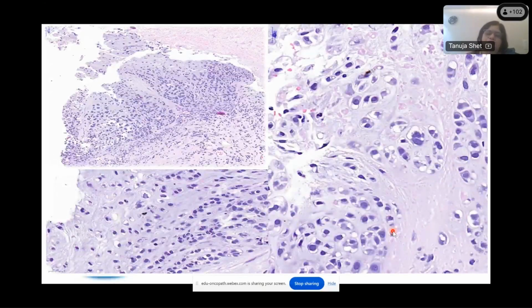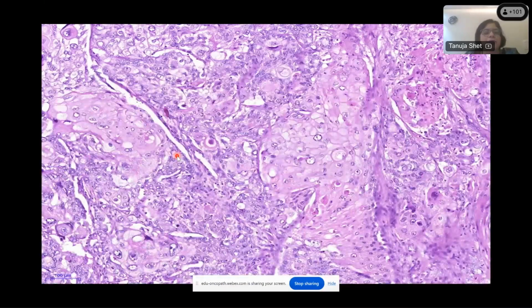Now we come to a different genre of tumor. Now these tumors, we are talking about epithelial. These are carcinomas that are showing you chondroid differentiation. You can see this is all chondrosarcoma, but you know it's in the breast, so you have to call it metaplastic carcinoma because it's an epithelial tumor that is now producing stroma. This is another metaplasia. That was a stromal metaplasia. This is an epithelial to epithelial metaplasia, and this is a squamous carcinoma arising in the breast. You call it an invasive carcinoma with squamous differentiation.